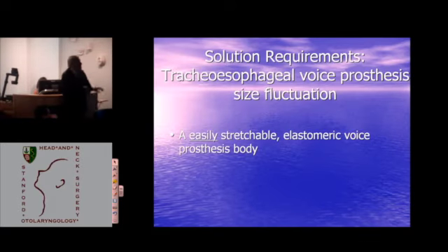So here's the proof. Next slide. And here's the device in place. So this is not a bare magnet against a perforation. It is encased in silicone as part of the manufacturing process. Okay, next slide. Okay, so let's talk about the TE wall that does this.